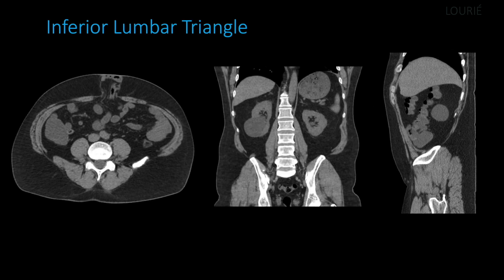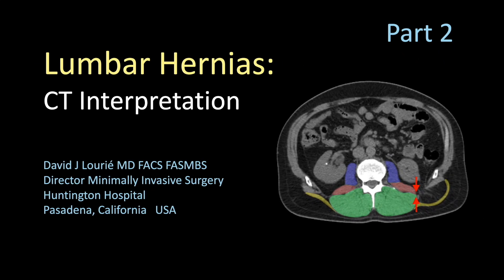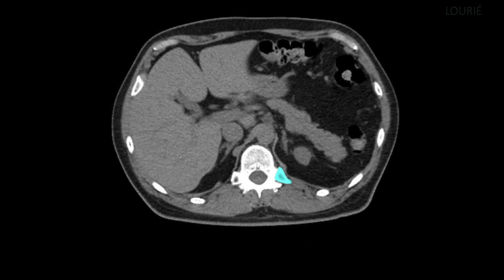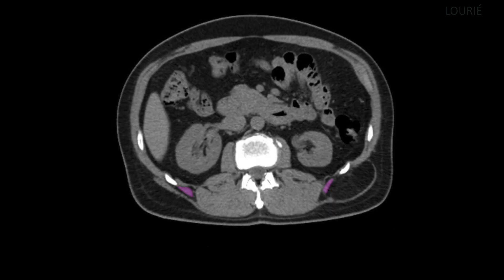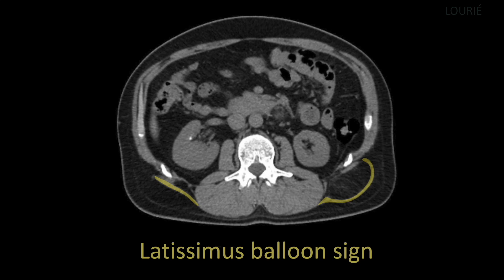Now that we have covered normal CT anatomy of the two lumbar triangles, let's put this together to better understand CT imaging of true lumbar hernias, focusing on key steps to CT interpretation of primary lumbar hernias, starting with the superior lumbar or Grenfell's hernia. As we follow the 12th rib distally to its tip, we begin to see an abnormal herniation. The serratus posterior inferior muscles in magenta form an element of the cranial border. On the patient's right, the flat unaffected latissimus dorsi is in yellow. On the left, the latissimus is pushed out in a large convexity — I call this the latissimus balloon sign, which is quite pathognomonic of a Grenfell hernia.